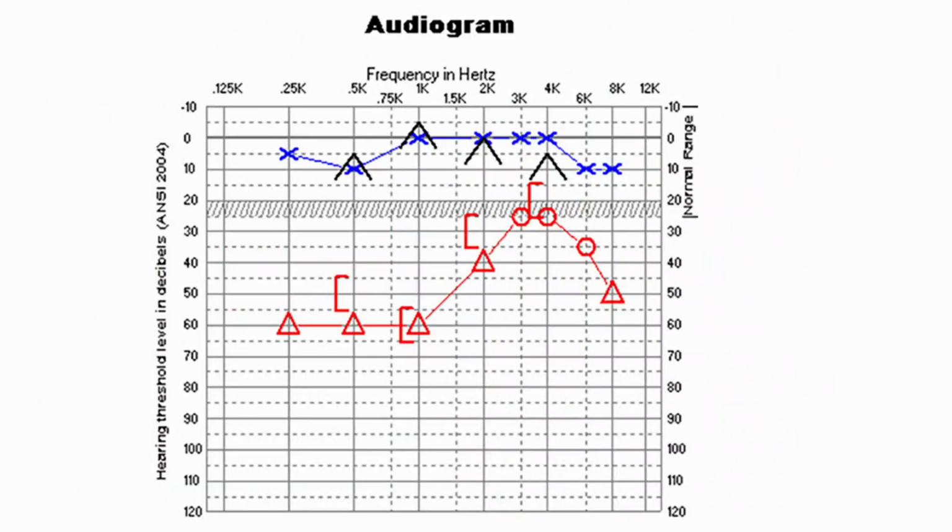There is another graph. If we look, the left side it's normal, but the right side it's diseased with both air conduction and bone conduction graphs below 20. But if you look closely, the bone conduction, air conduction is masked. So I have told you in my previous part 1 lecture that masking in air conduction is carried out if the difference between the air conduction of two sides is more than 40 decibel. So here the difference is more than 40 decibel, that's why the right ear is masked.